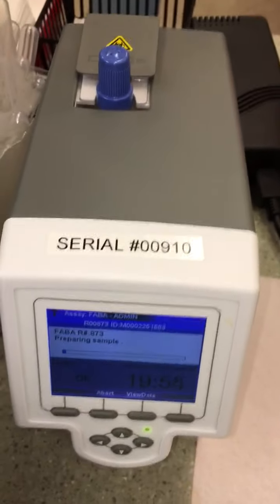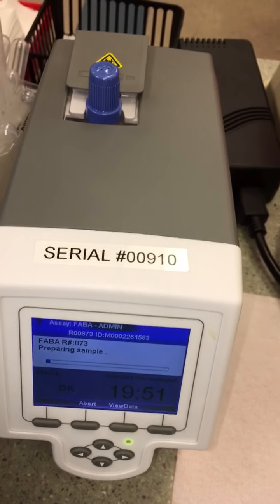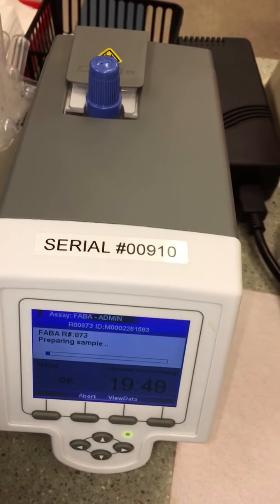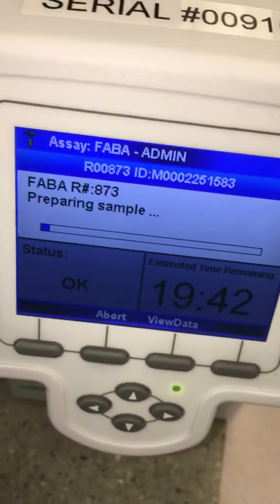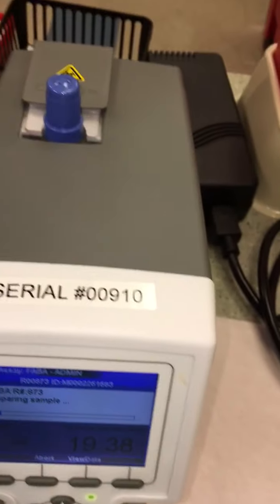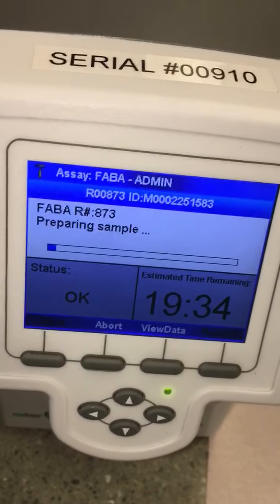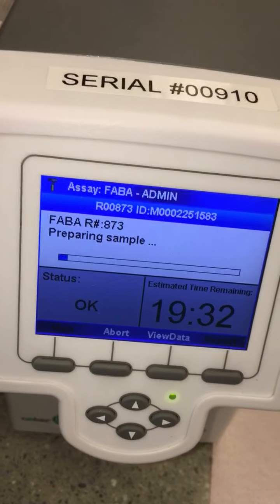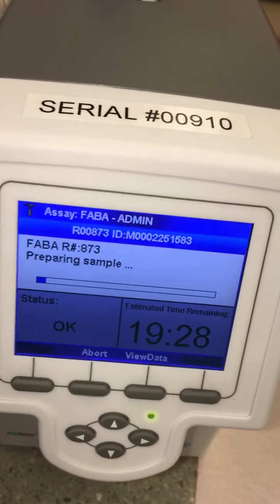So this is going to take quite a while, so I'm not going to keep this video running the whole time. I will produce a third video which shows you how to access the result once this testing is done, and you'll see how we would read the result on the digital display and be able to report that out then. But for now, this is the general method of testing with a LIAT made by Cobas, molecular method, looking at the ability to detect viral presence at a very sophisticated level.